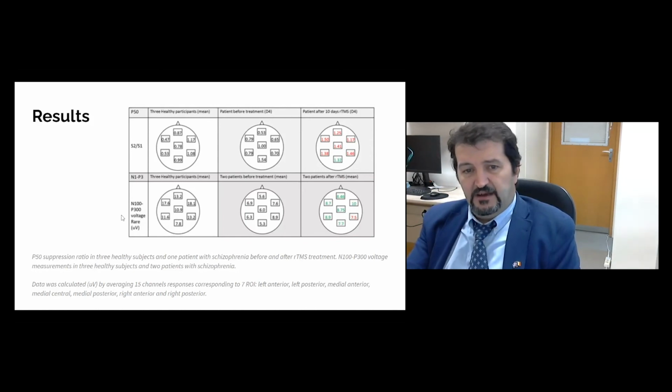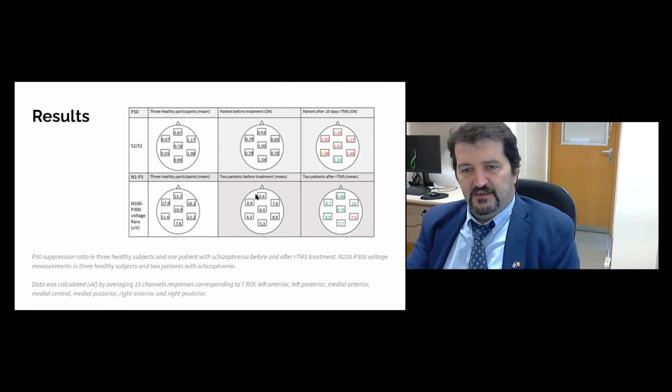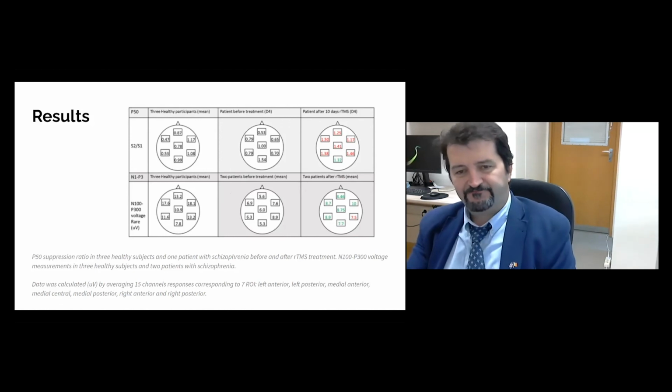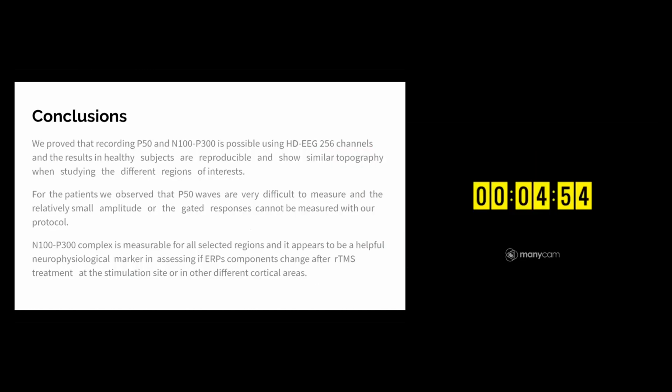And then the other findings for the voltage of N100 P300 are that, yes, they improved this complex of attention, but we only had 2 patients here, so we have very little data, and we have limits, of course, in interpreting this. The main problem left.